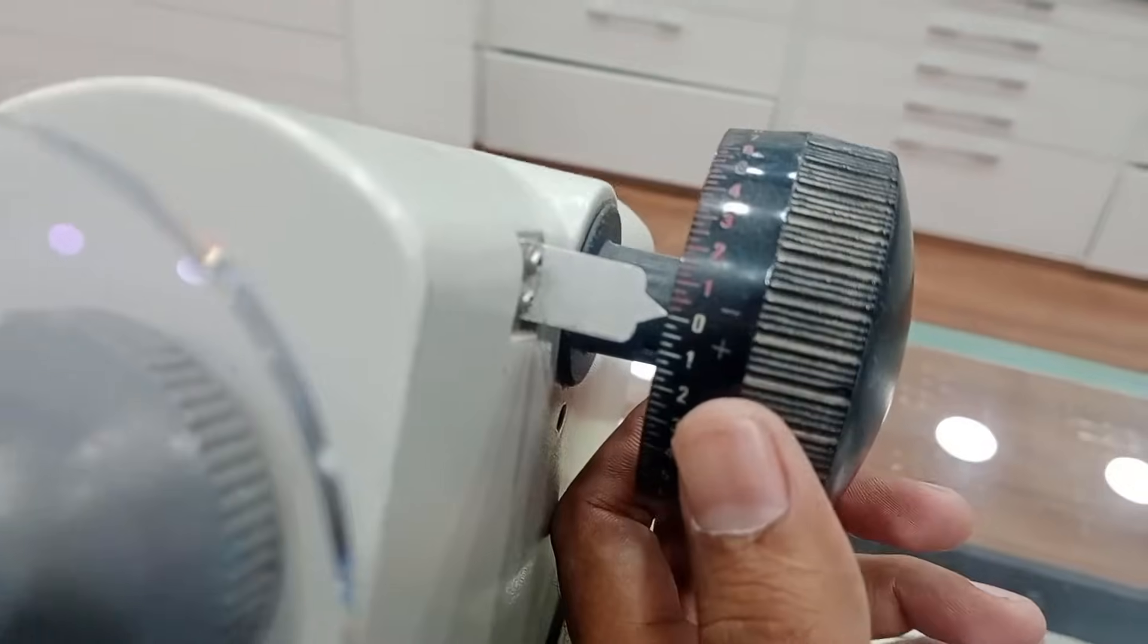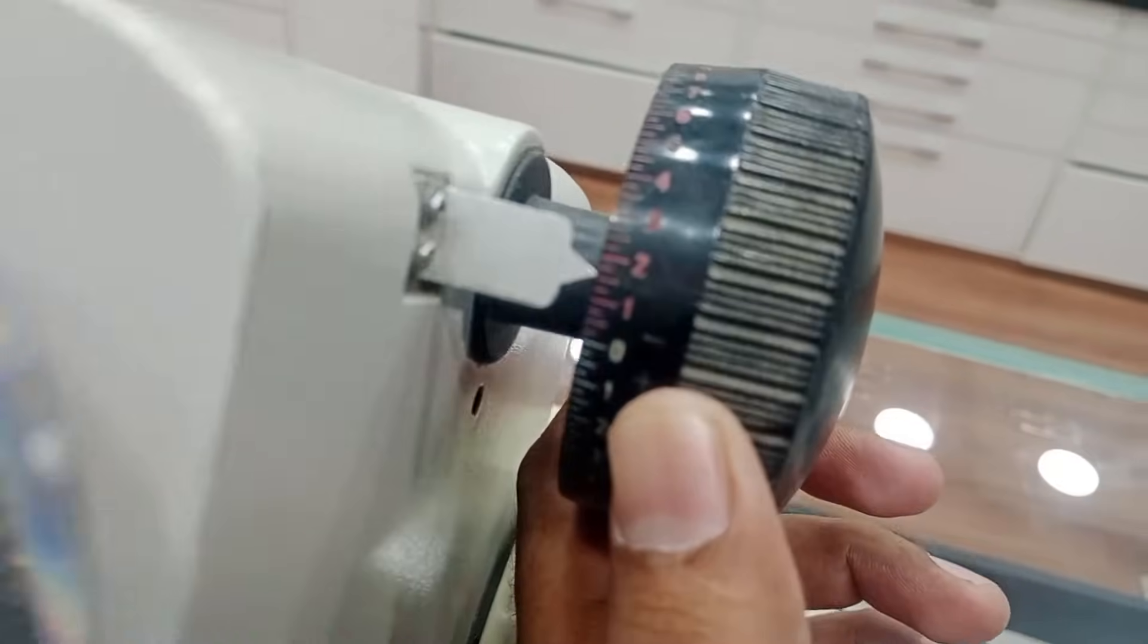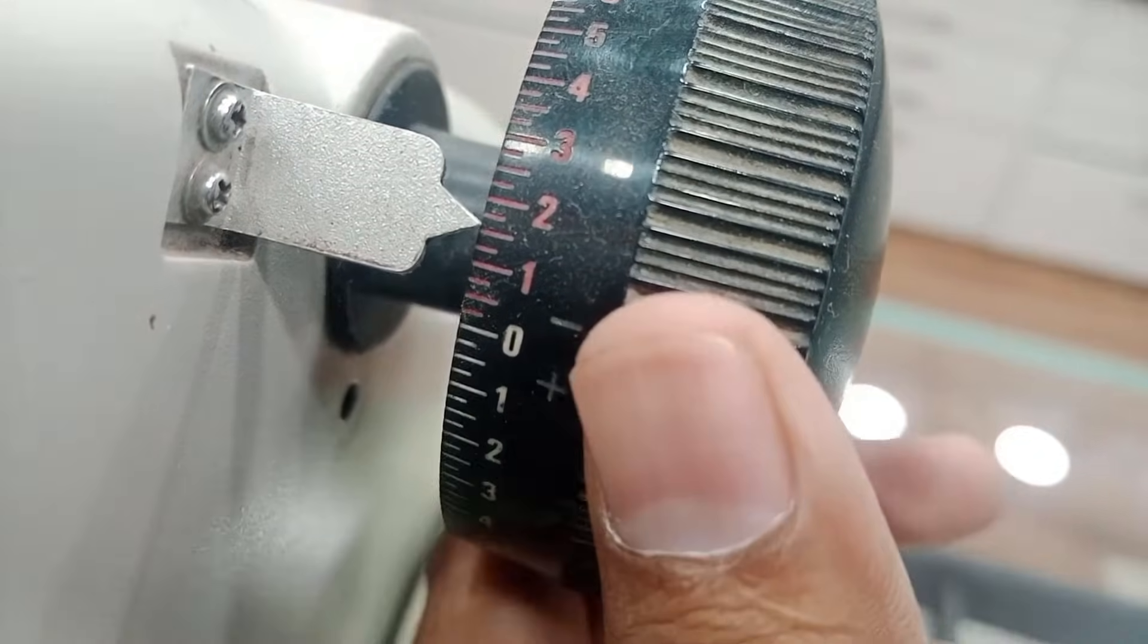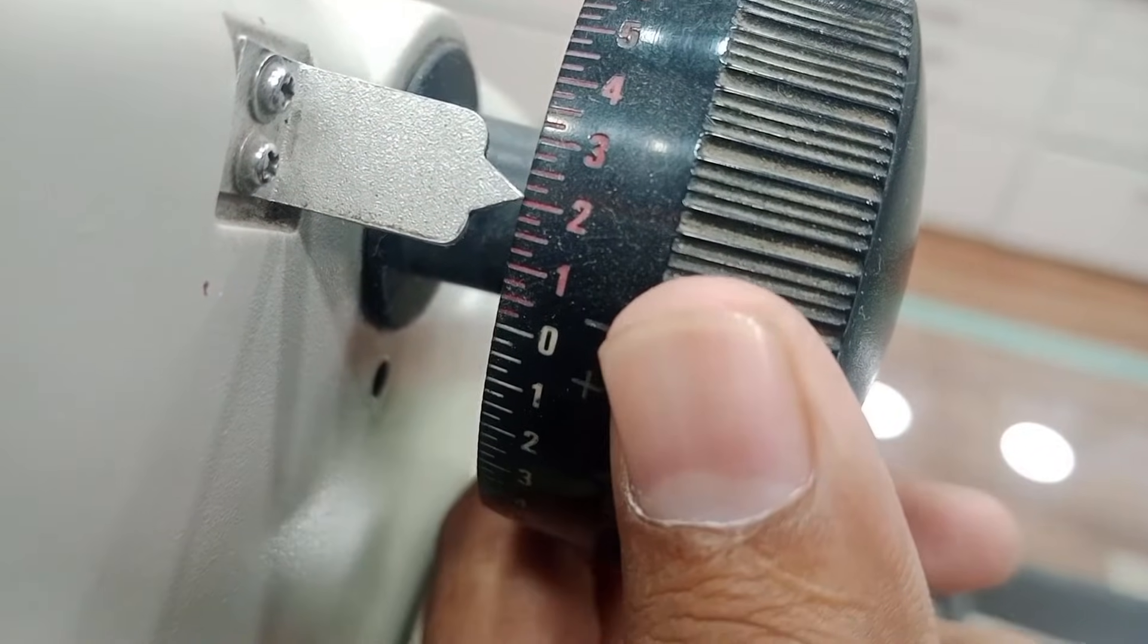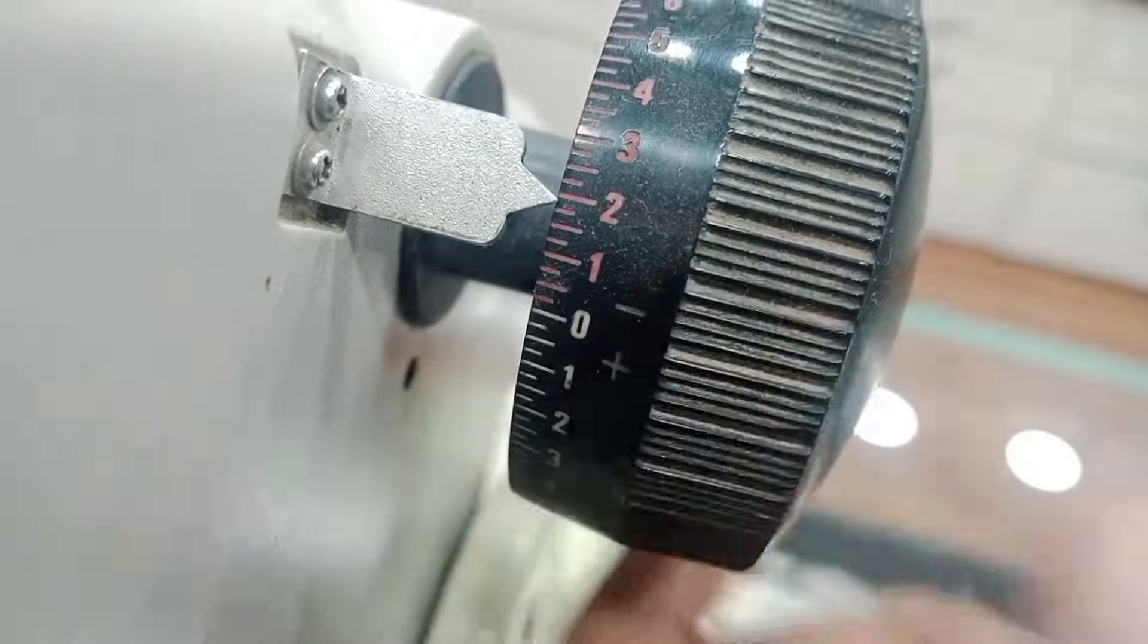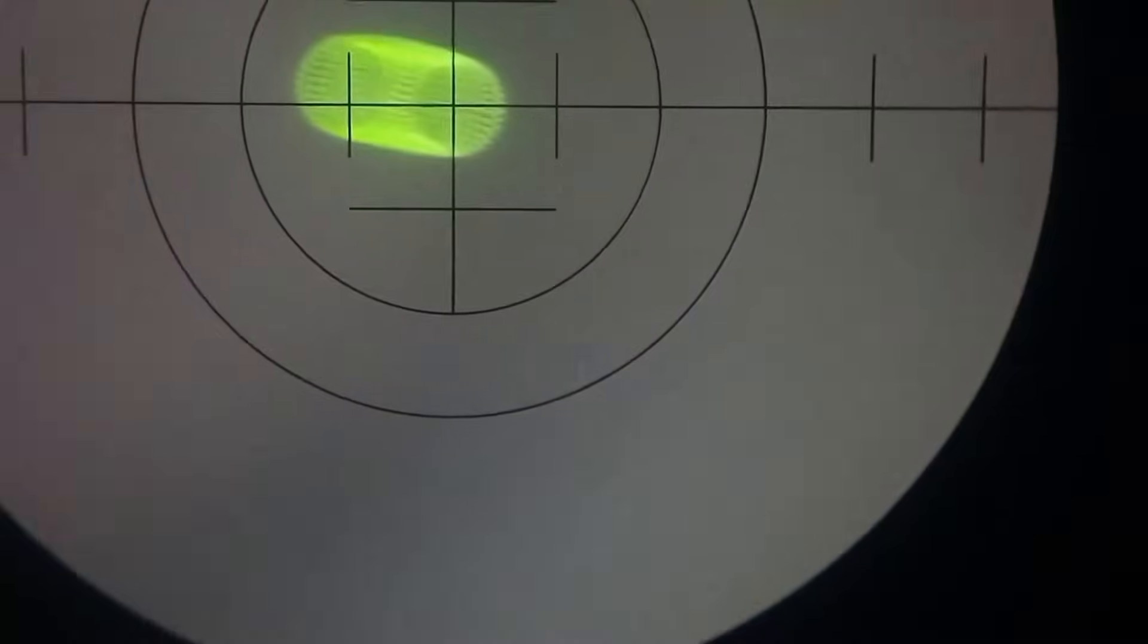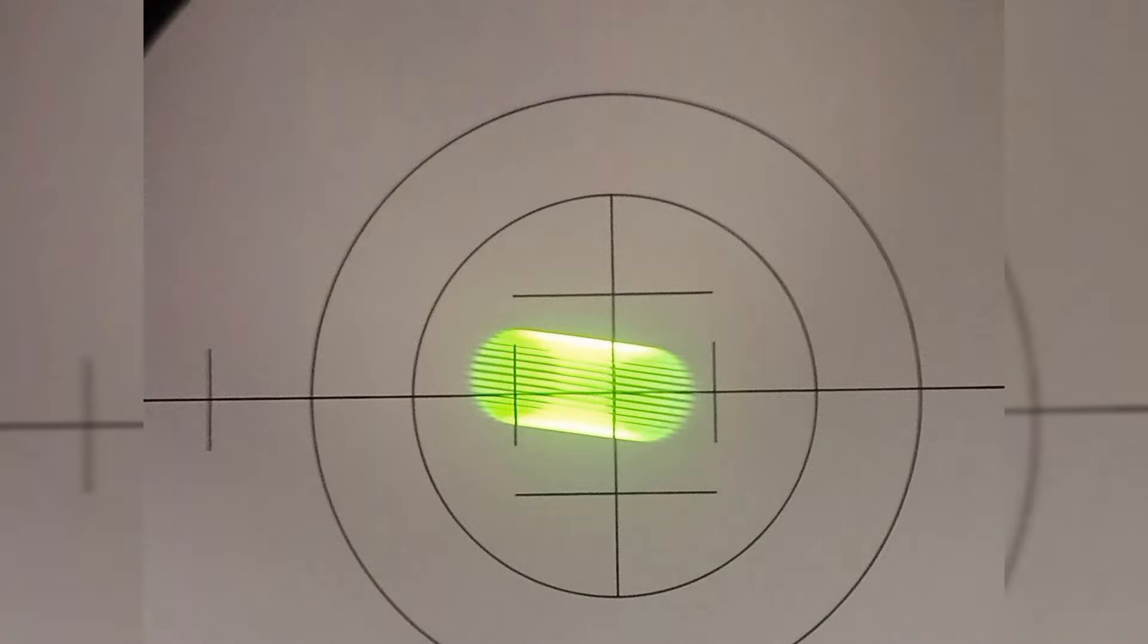And now we will rotate the power dial. Now we will clear our other meridian, the fellow meridian. And as you can see, if I am rotating the power dial, the other meridian is getting clear. It's totally clear, as you can see.